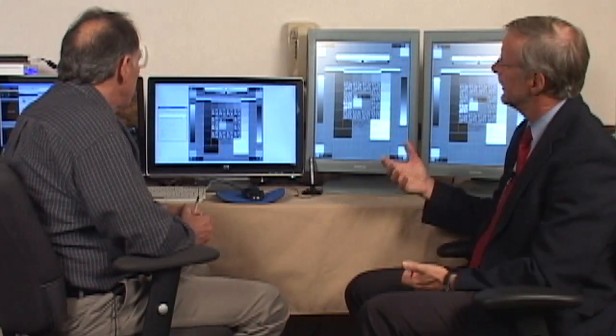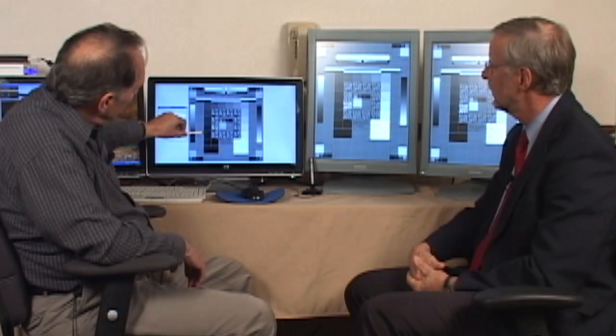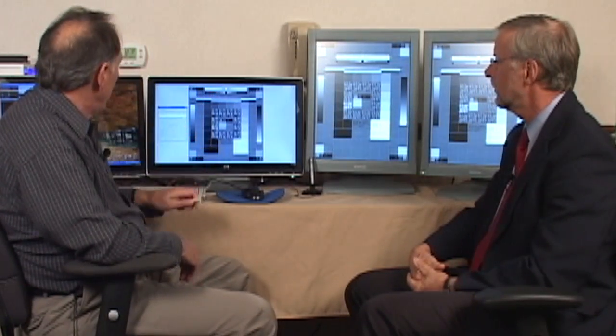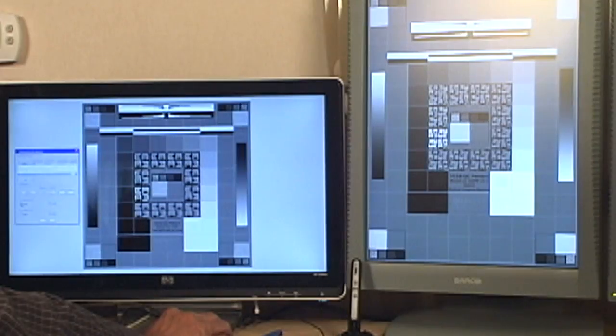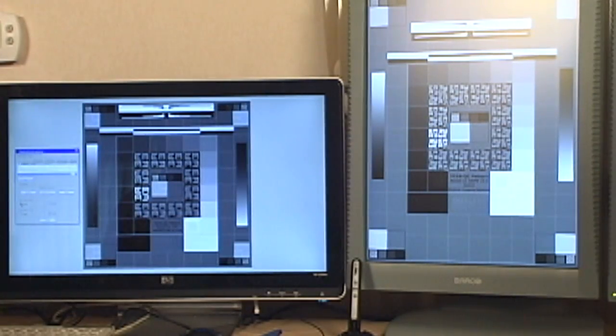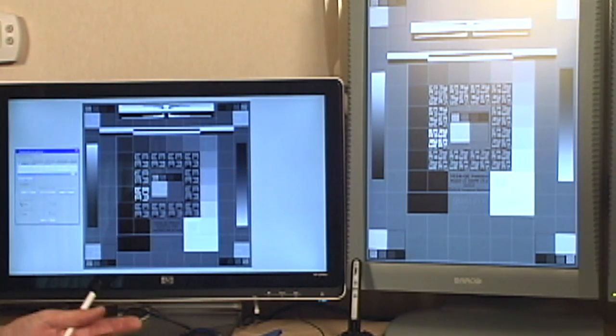Yeah. So for example, that's one of the key differences between a commercial and a medical display, because they're not calibrated accordingly to optimize for medical viewing. In the dark areas, what you tend to see is a very bright area here with fewer differences over here. Right now I have the calibration on this one disabled, and if I go in here and enable it, you can see an immediate jump and change in the actual darkness of the image. It becomes darker because we're correcting for the lower end more than anything else.